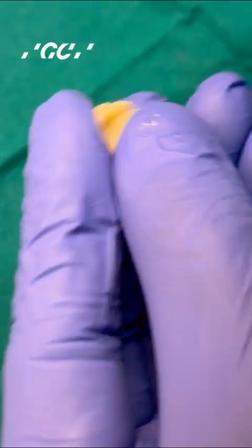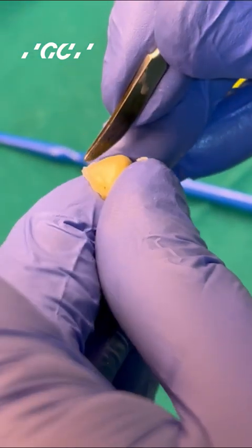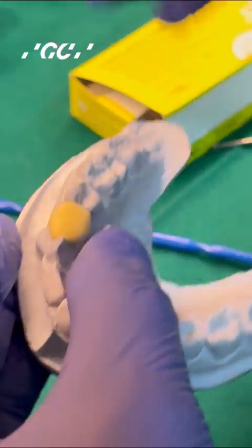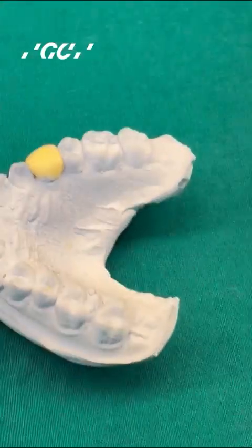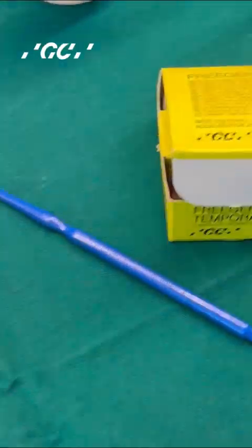Take off the excesses; you can polish it with a buff or with your composite polishing kit. Once you are done with polishing and final finishing and shaping, you place it in the patient's mouth and it is ready to be cemented. Remember: the initial cure is a tack cure, after which you retrieve it either from the model or from the patient's mouth, finish it, polish it after the final cure, and then cement it. The cementing is always done with a non-eugenol temporary cement, which is called Freegenol.